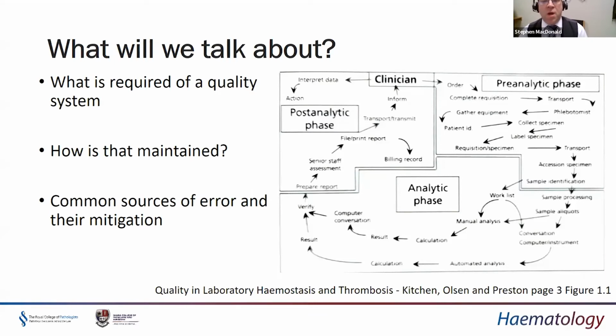And of course, what we'll talk about at the end is common sources of error and how we can mitigate those potential errors within the laboratory.